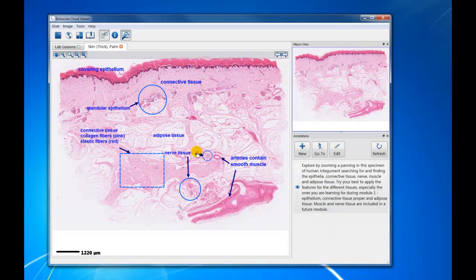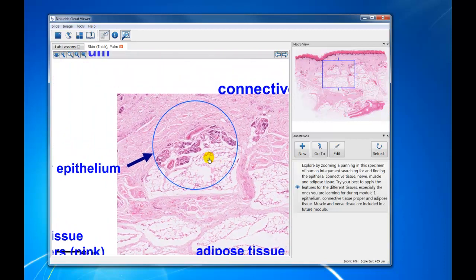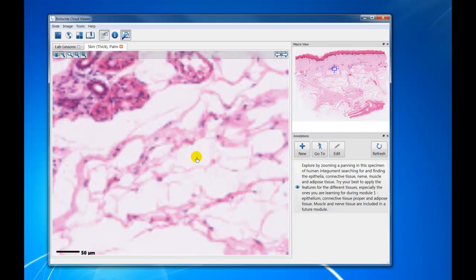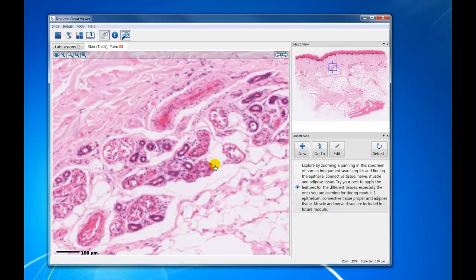And the advantage here is if you want to look at glandular epithelium, you can center it like this, and you can either use the plus or minus keys up here, or you can use your mouse wheel and go up to the highest magnification. Now we're not giving ultimate detail annotation here. You're getting that at WebMic and your lectures.